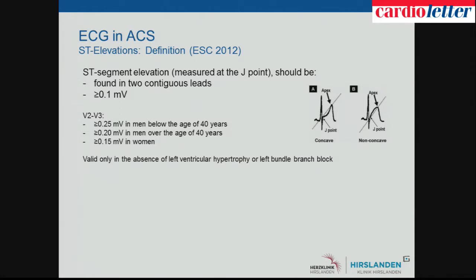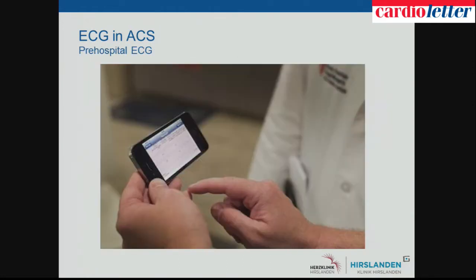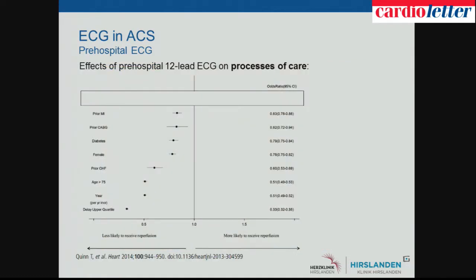So this is quite old, we all knew. Is there changing diagnostics with the electrocardiogram, which we have known for almost 100 years? Yes, there is. I think when we speak nowadays about ECG, we should have a look at pre-hospital ECG with telemetric devices. Here you see the example of an ECG on a smartphone. Is this something that has impact on our process of care, and does it make sense to do pre-hospital ECGs?